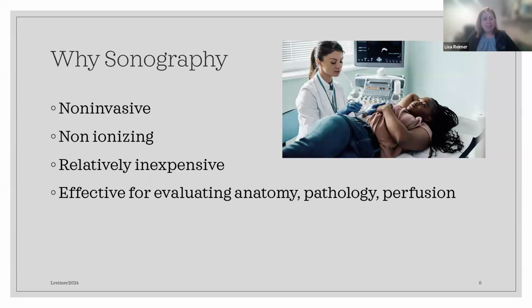So I say to all prospective students and current students, why I love sonography is we're safe, we're portable, and we're affordable. That's my spiel. And I think that it's really helpful because this gives us an opportunity to assess patients quickly and get a sense for where they are from a renal structure standpoint, perfusion standpoint, and we can even get those Dopplers to see, are they starting to fall out of the abnormal range?